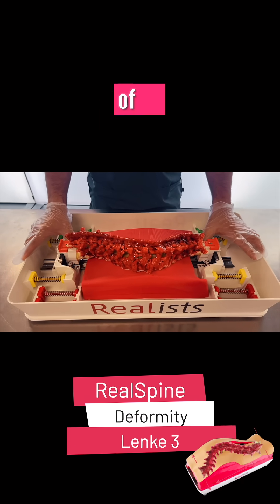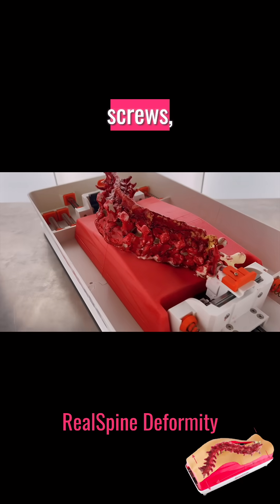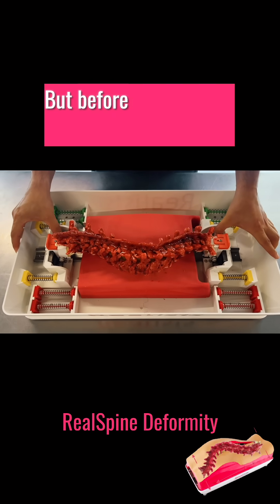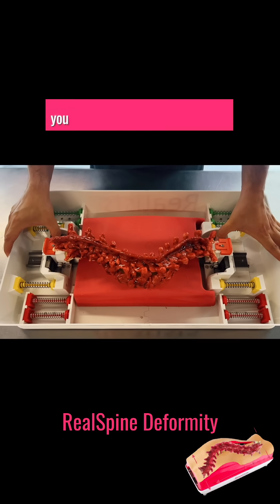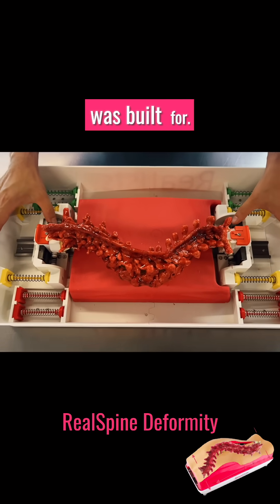Correcting the abnormal curvature of the spine requires accessing the vertebrae, placing rods, screws, and hooks to realign them — and doing it with precision. But before correcting a spine in the operating room, you must understand it, feel it, and master it. That's what this simulator was built for.